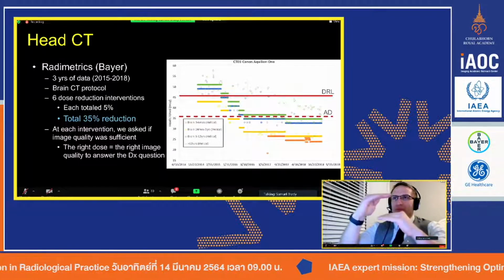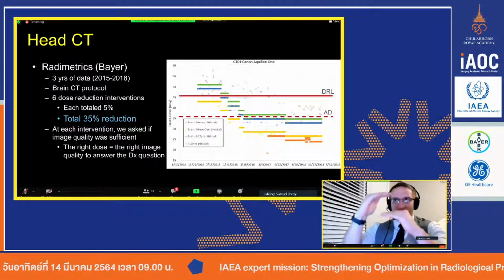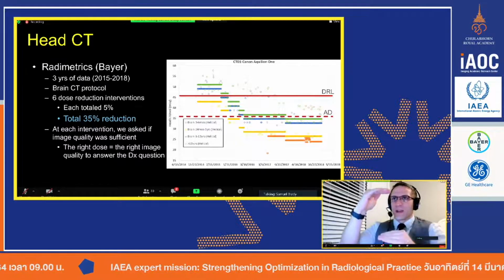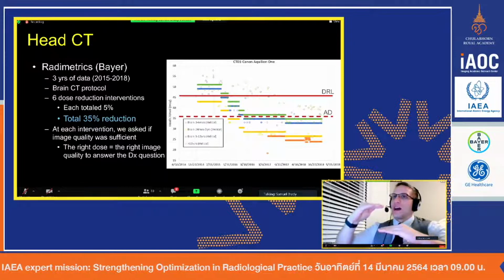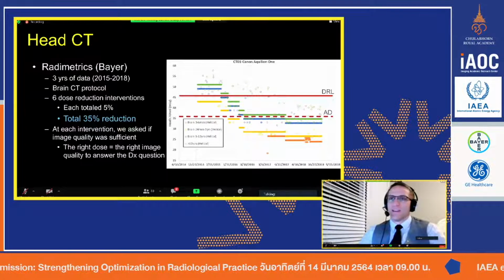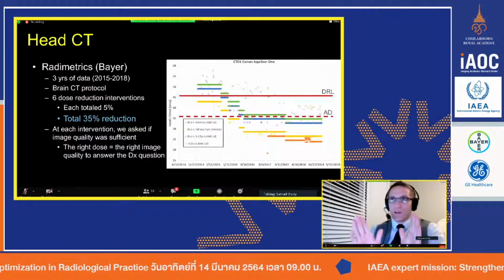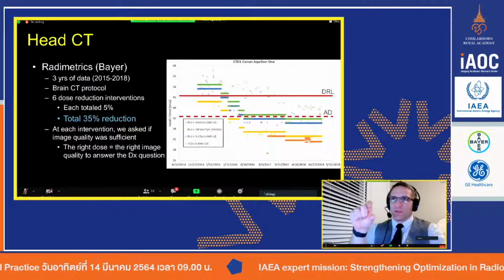And so with tube current modulation, you have to change the noise index value, whatever it's called on each vendor, and you have to change your minimum and maximum mA. In this case, you need to lower your minimum so it allows less radiation. So you can see it's a little bit more complicated with tube current modulation, which is fine, but fixed mA is really easy. It's just one number to turn.